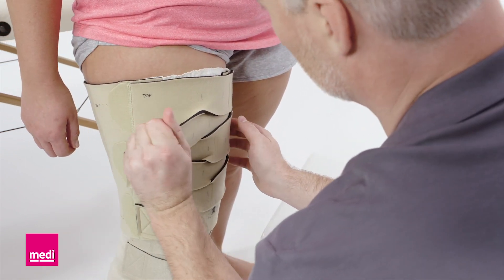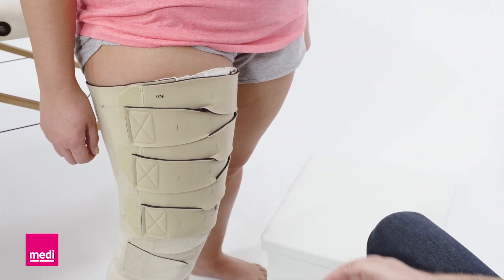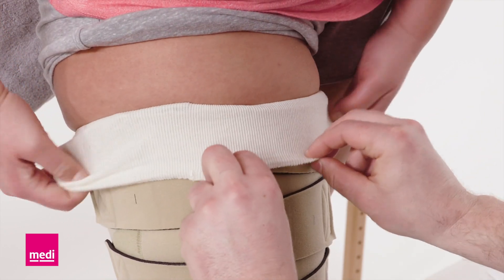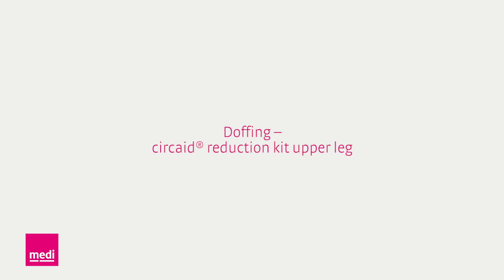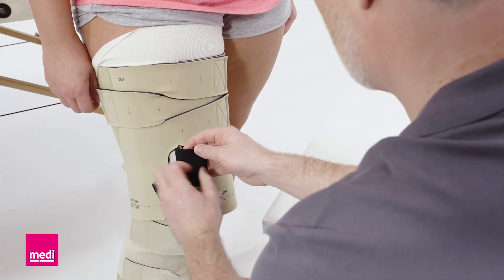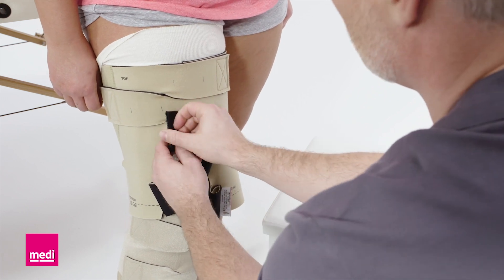The bands should be tightened within the tolerance level of the patient. For an effective therapy, you or your patient should readjust the compression throughout the day. Lastly, fold the undersleeve over the top of the garment. Roll back the bands to keep the hook fasteners lint-free. Make sure not to detach any of the spine taps.